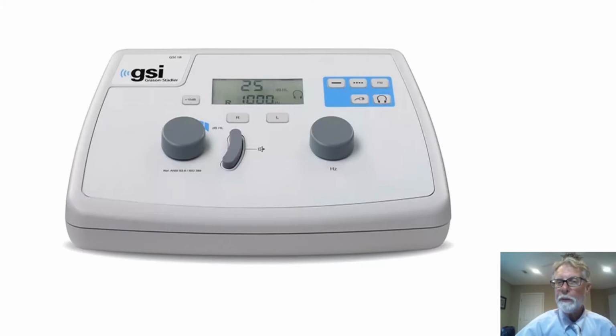On the upper right-hand side in blue, you see some other buttons. These are to change the type of stimulus. The ones on the top, left to right. The first one, on the left, is for what we call a continuous tone. So it is whatever frequency and whatever intensity, and it is applied to the patient as stimulus whenever the interrupter, the stimulus present button, is pushed.